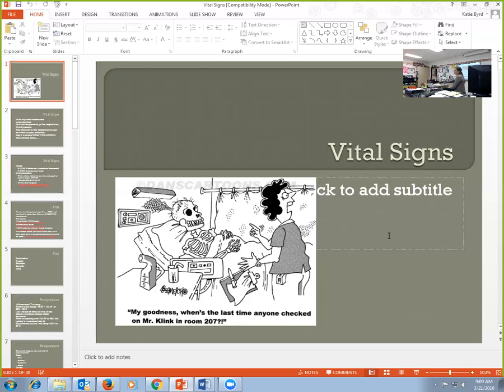Tympanic, this is pertaining to the eardrum. Your tympanic membrane is your eardrum, which makes sense, right? You think of a timpani in the band, that big drum that's got the white top on it. Thermo is a root word for heat. So a thermometer is measuring the heat.